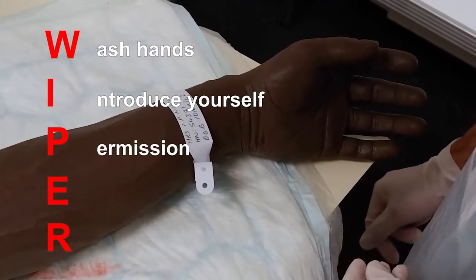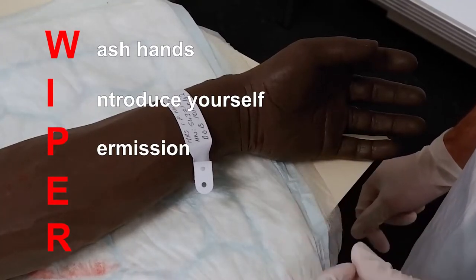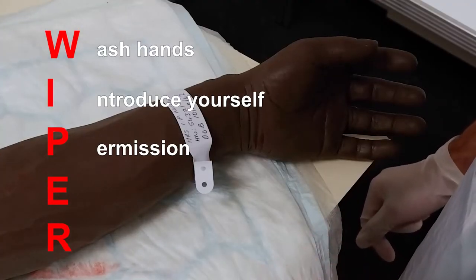Seek permission to carry out the procedure from the patient, ensuring that you have fully explained the procedure and the reasons for doing it.